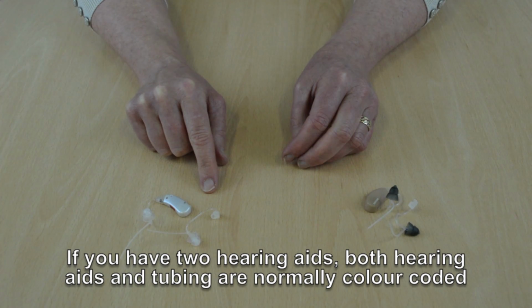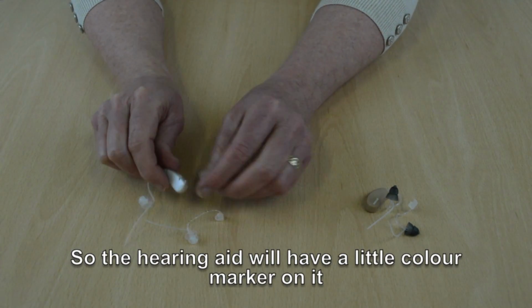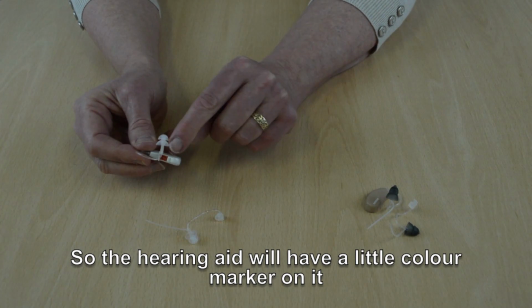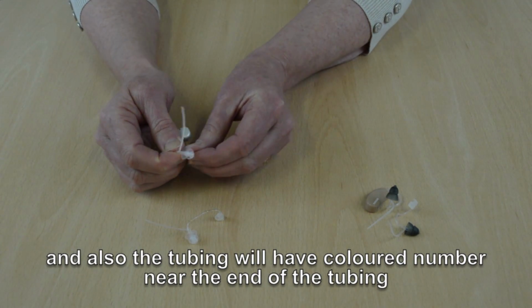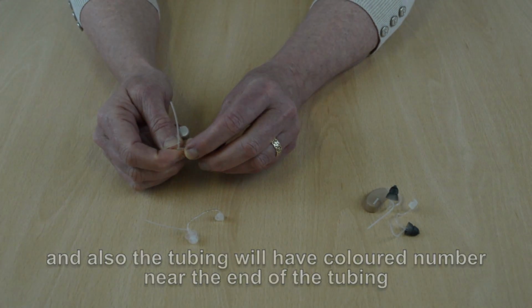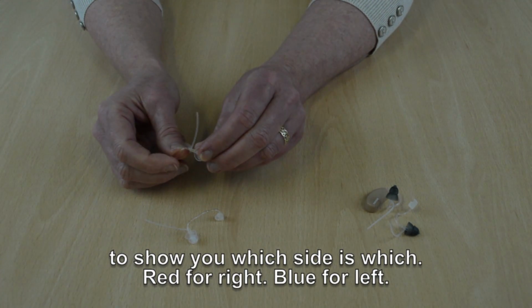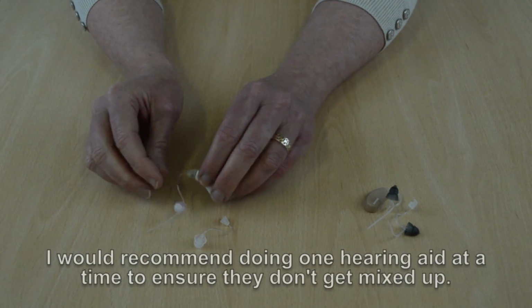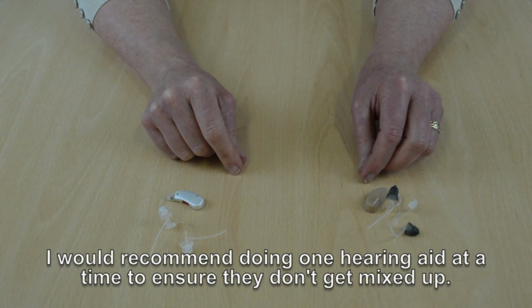If you have two hearing aids, both the hearing aids and tubing are normally colour coded. So the hearing aid will have a little colour marker on it, and also the tubing will have a coloured number near the end of the tubing to show you which side is which. So it's red for right and blue for left. I would recommend doing one hearing aid at a time to make sure they don't get mixed up.